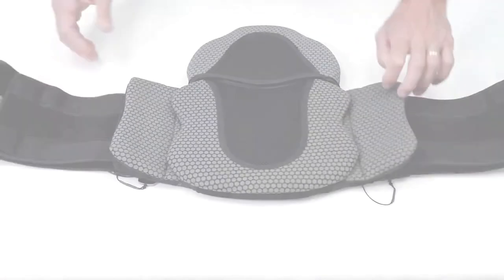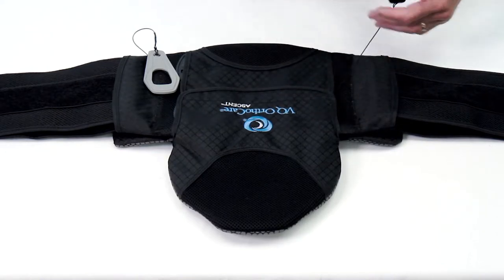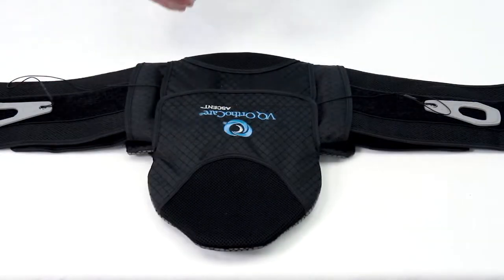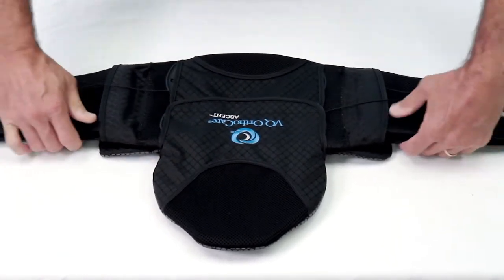For a proper fit, prepare the brace by ensuring it is fully extended prior to each application. Place the pull tabs close to the back panel and create slack in the pulley system by pulling the ends of the belt wraps away from each other.